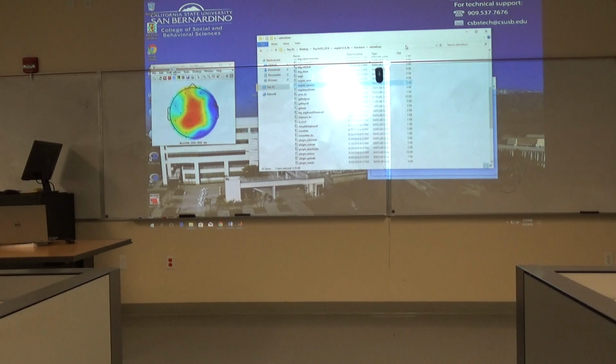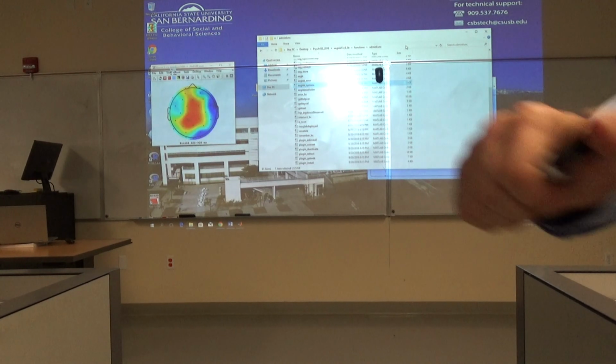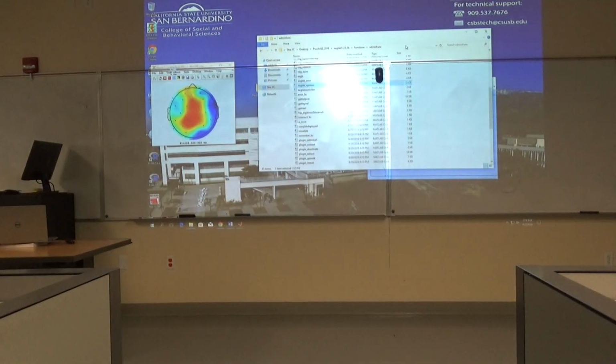Now save that file, by the way. Save. Now can you show her? Do you remember that? Oh, okay. So snap that. Oh, you're good. You're already set. You're just so close.